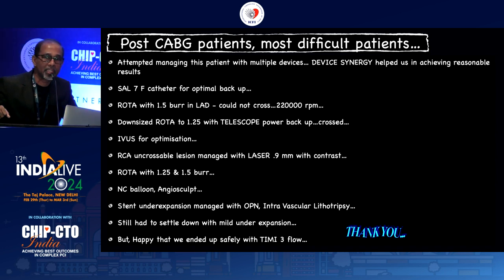Still had to settle down with a little bit of under expansion, but we were happy at the end of the day that we ended up with a safe procedure and a TIMI 3 flow, and the patient did well. He's doing well for the last 3 months. Thank you so much.